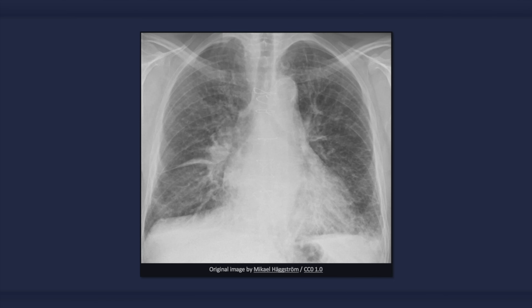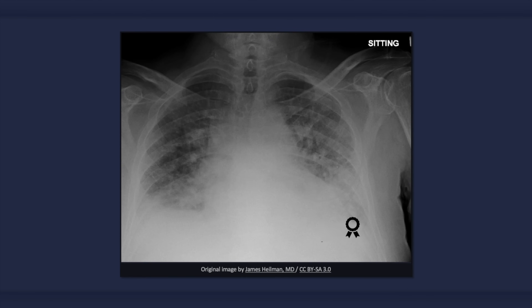Alveolar edema is a more severe sign of congestive heart failure and is not clearly evident in the radiograph we have thus far been examining. In this image, many of the aforementioned findings of congestive heart failure are present, plus alveolar edema, which classically results in central and symmetrical airspace disease. The outer third of the lung is frequently spared, resulting in a characteristic bat-wing configuration. However, the patterns of pulmonary opacification are variable and can be more or less diffuse, asymmetric, or patchy.